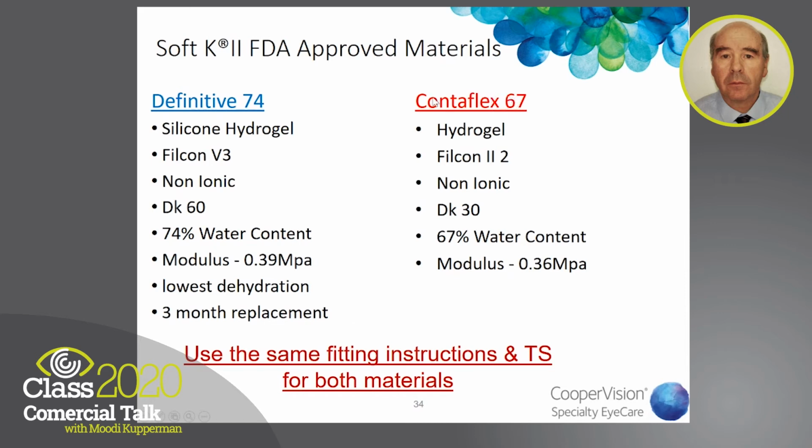The other material is the Contaflex 67, also Contamac, hydrogel, non-ionic. The DK is half of the silicone hydrogel, 67% water content, and the modulus is about the same, 0.39 and 0.36. And the same fitting instruction and trial set for both materials. This is very important.